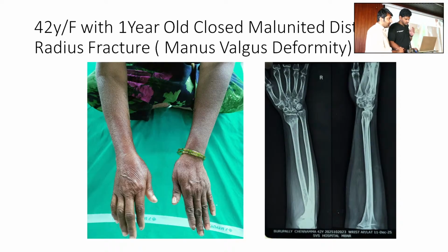And if you take a lateral view of the limb, you show the dinner fork deformity. And the deformity is not that much. The problem is this: there is a 15-degree angulation. Angulation only, but she's worried about this area only. Yes, sir. Pain, ulnar pain.